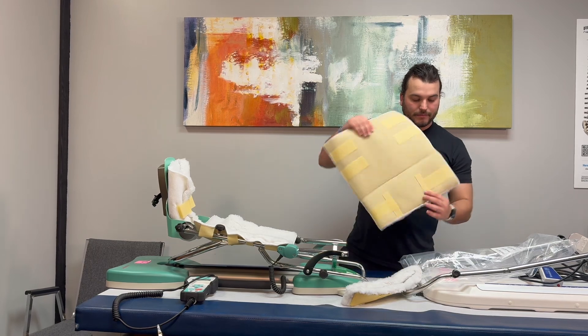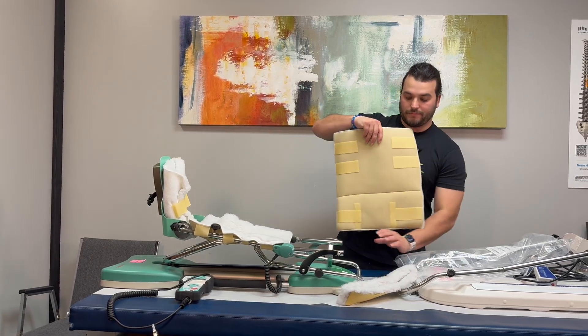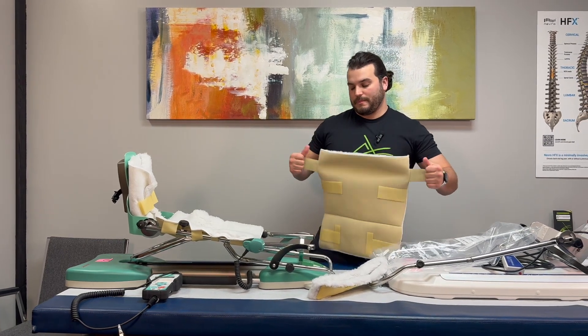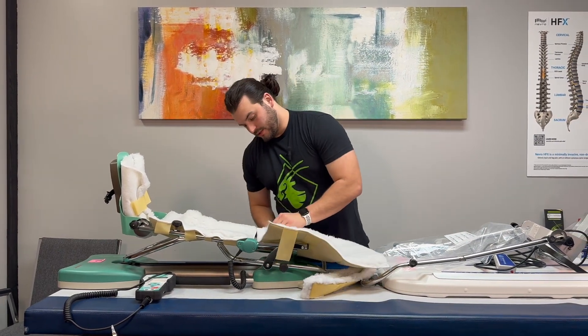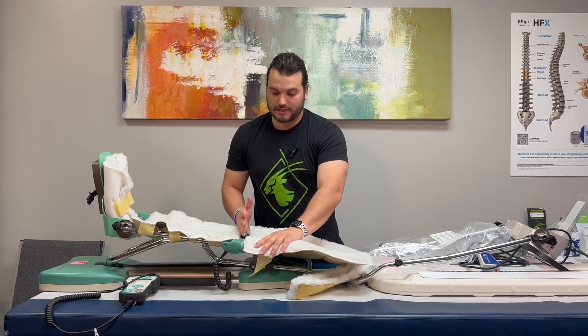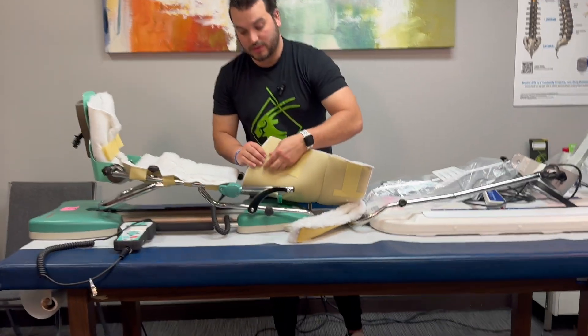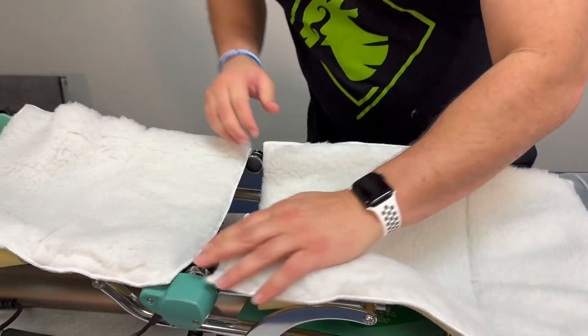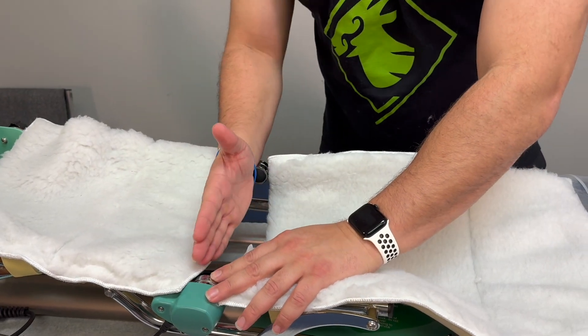When you have the bigger pad, these are the bottom straps right here, and then go to the very end of the CPM. I especially like to put the pads on two different areas of the CPM where these hinges are, because it is going to start bending whenever you are in this device. As you can see, I have the hinges separate.